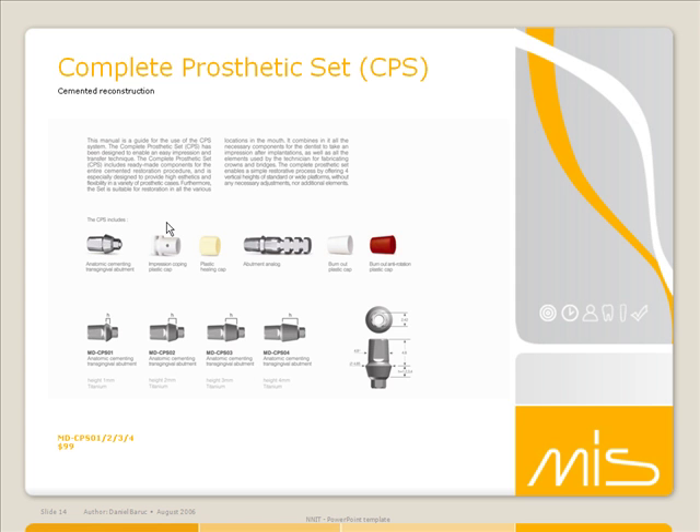The patient is now finished with their part of the restoration for now. You'll then take the impression with the plastic cap inside it and send it to the lab along with an abutment analog, which is an exact replica of this abutment on top of a lab analog. This analog goes in, you torque it down, and it's ready to go. You're not prepping it because otherwise the rest of this kit becomes negated.